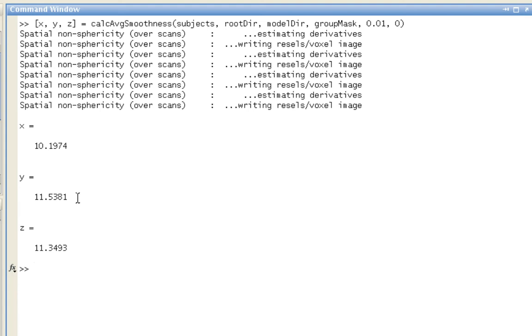Note that in this experiment that I used this function on, the applied smoothing kernel was 8 millimeters. Why are these estimates significantly greater than that?